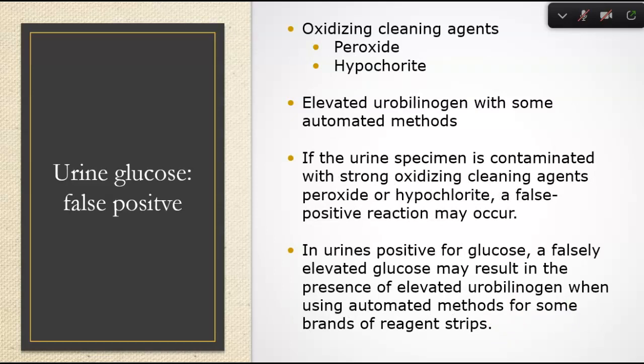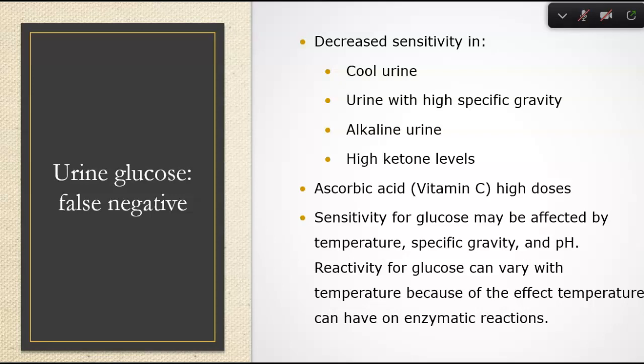False positives can come from oxidizing cleaning agents, peroxide, hypochlorite, elevated urobilinogen in some automated methods, or contamination with strong oxidizing agents. False negatives can occur with decreased sensitivity in cool urine — because it's cold and enzymes slow down — alkaline urine, high ketone levels, high specific gravity, or ascorbic acid in high doses. Normal vitamin C isn't a problem, but high doses can inhibit the enzymatic reaction. We should wait at least 24 hours after the last vitamin C intake for accurate results.